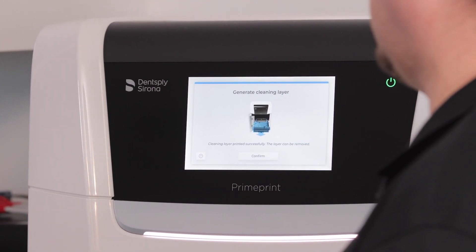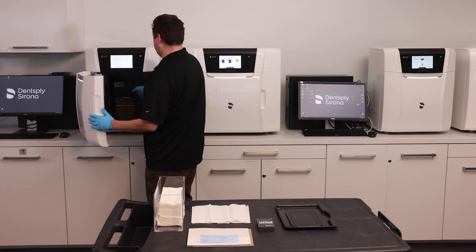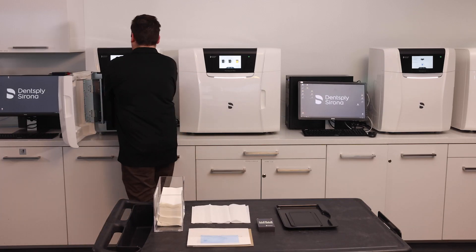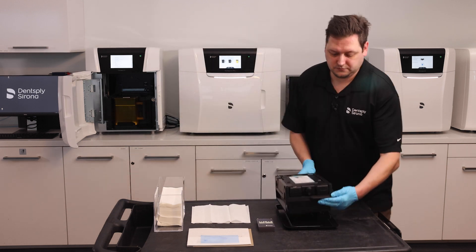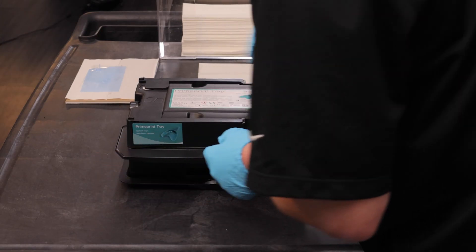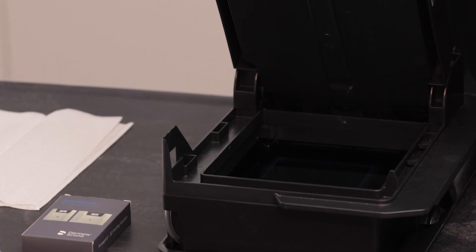The cleaning layer has been printed successfully. I can now remove it. I take out my material unit. It's difficult to see, but it is printed there.